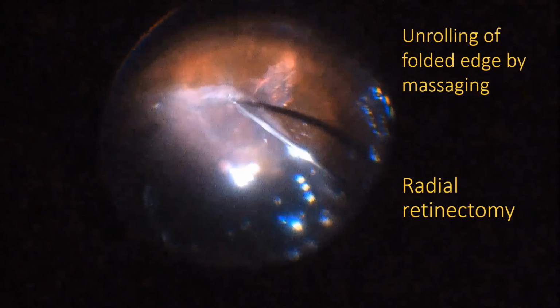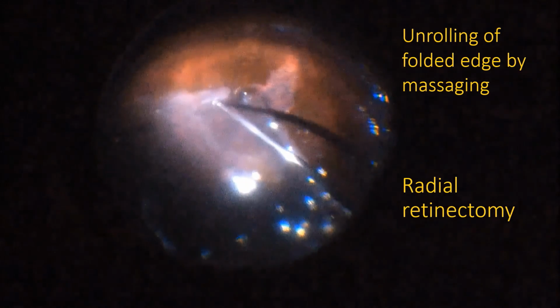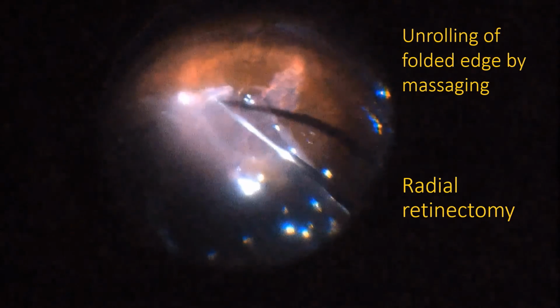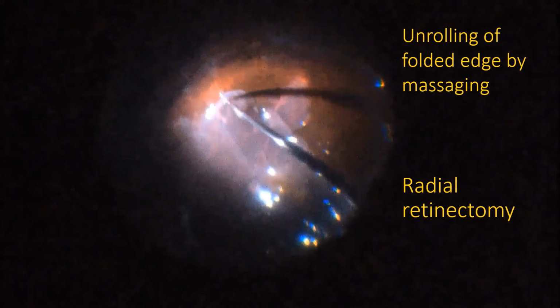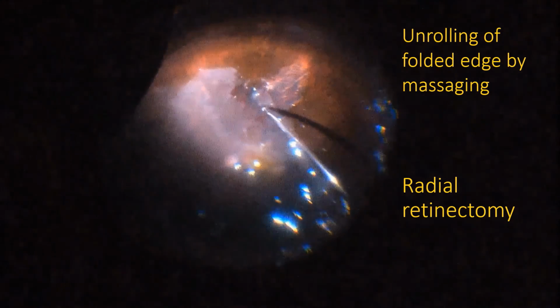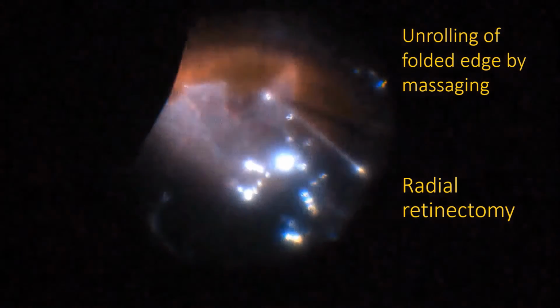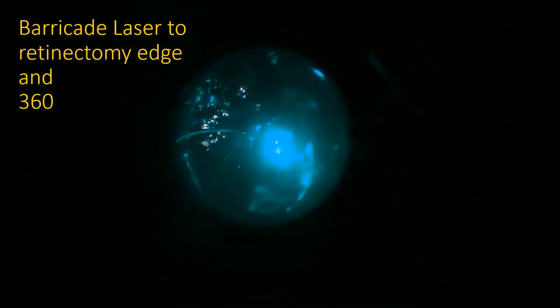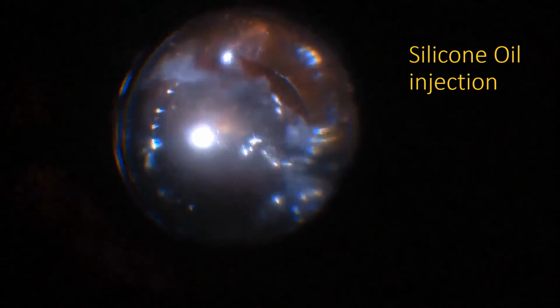After the circumferential retinectomy, the retina edges folded inward. This was unrolled by gentle massage. Finally, a radial retinectomy was performed to relieve the centripetal force. Endolaser was applied to the retinectomy edge for 360 degrees. The silicone oil was injected.